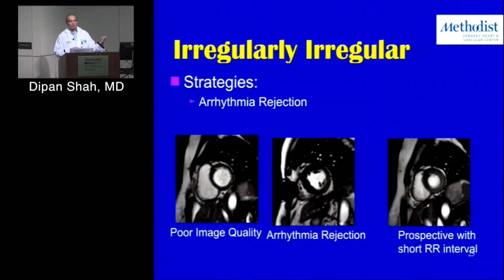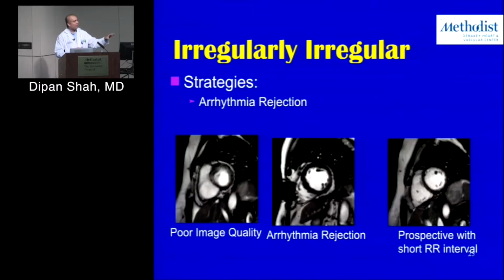And so for those of you, when you rotate through the labs, you'll see we use a variety of these different strategies. And there's not one strategy that works every time. It really depends on each patient. And so you go through and, based on the type of arrhythmia they're having, decide which particular strategy you're going to employ.